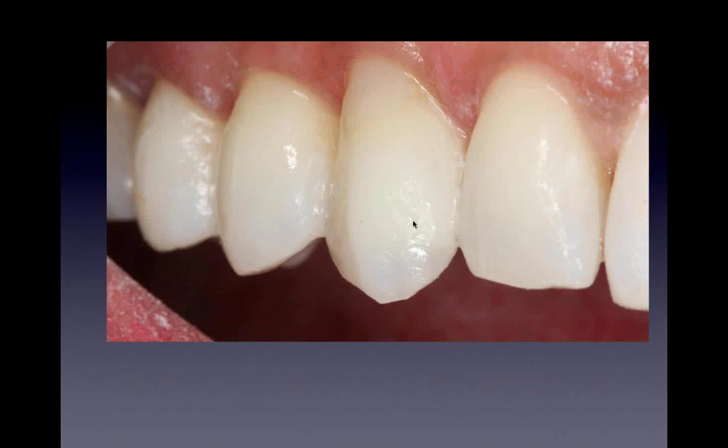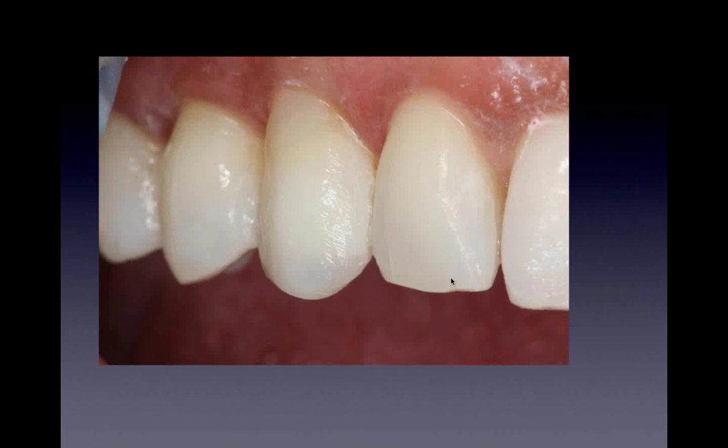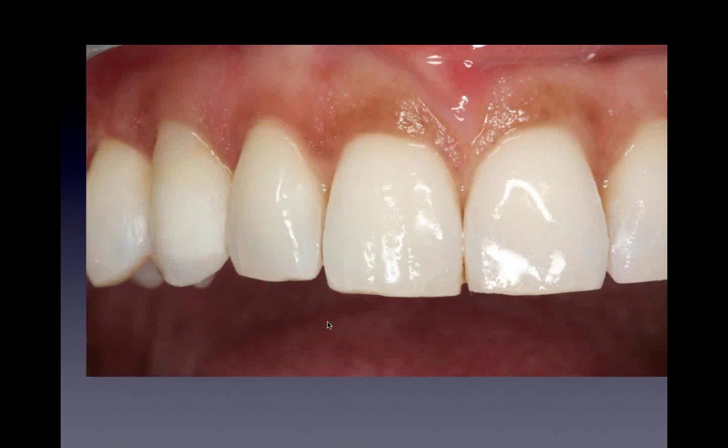Now, I like to build up and I like to contour. I did this on Monday just because it came into the office, and I figured I would share it with you. I like to make a nice, beautiful canine that looks natural and aesthetic, and it's nice and pointy because it looks younger. When she goes into occlusion, she starts hitting it, so I have to keep taking it down. I'm showing you how I'm re-sculpting the aesthetics to follow the function.